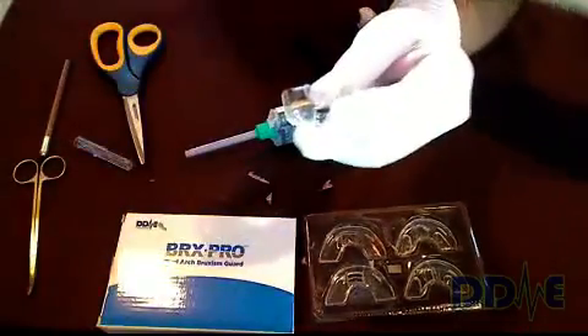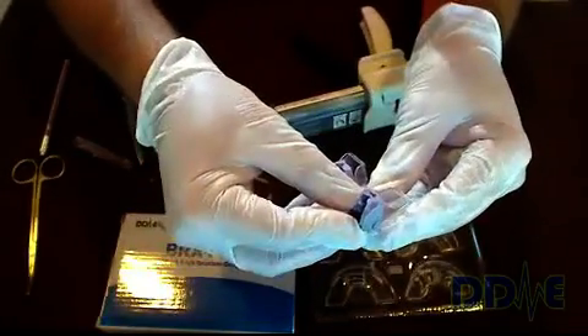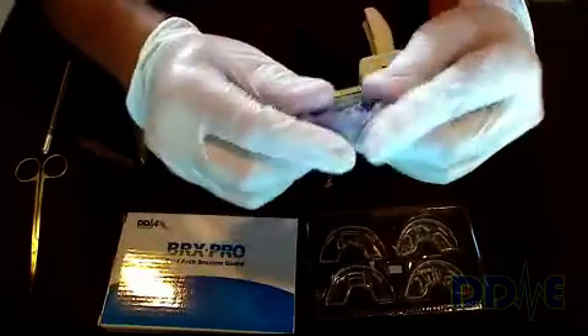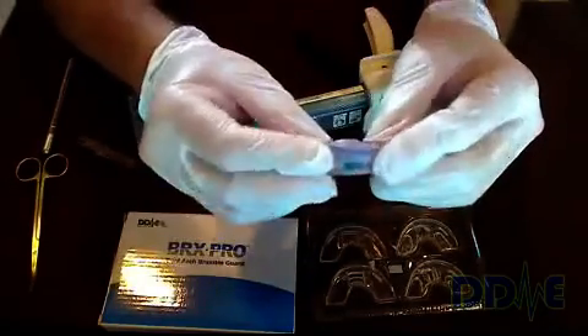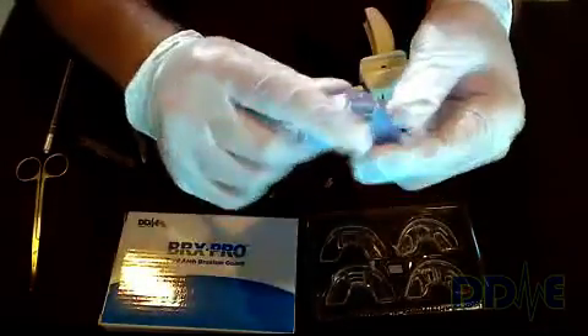When inserting the insert into the tray, put the front edge in first and roll it in, then start pushing from the back. Once you get close, it actually snaps — you'll feel and almost hear it snap into position. So we have our lower with the insert in the tray and the slots. Very adjustable.